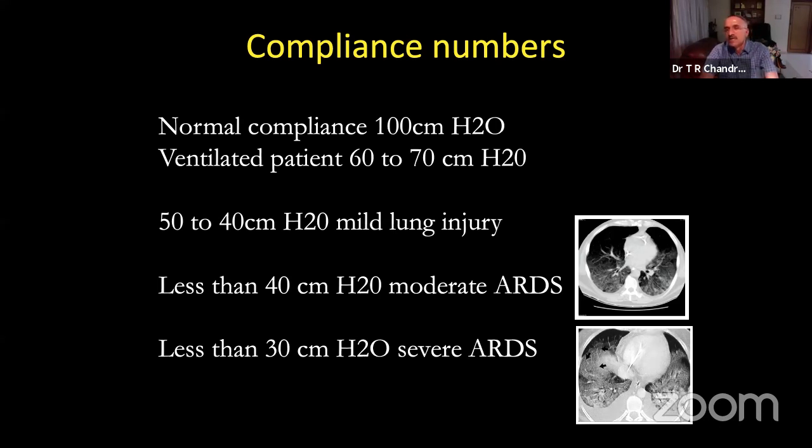See, what I'm trying to impress upon you is there is so much information about the airways and the alveoli. You just have to know what to look at, and you can ventilate the patient without doing unjustified ABGs. I've seen 4 ABGs when the patient is normal, 2 X-rays, a small deterioration, X-ray is done. That's not the way you can ascertain what is the problem and do a lot of correction if you know the graphics very well.